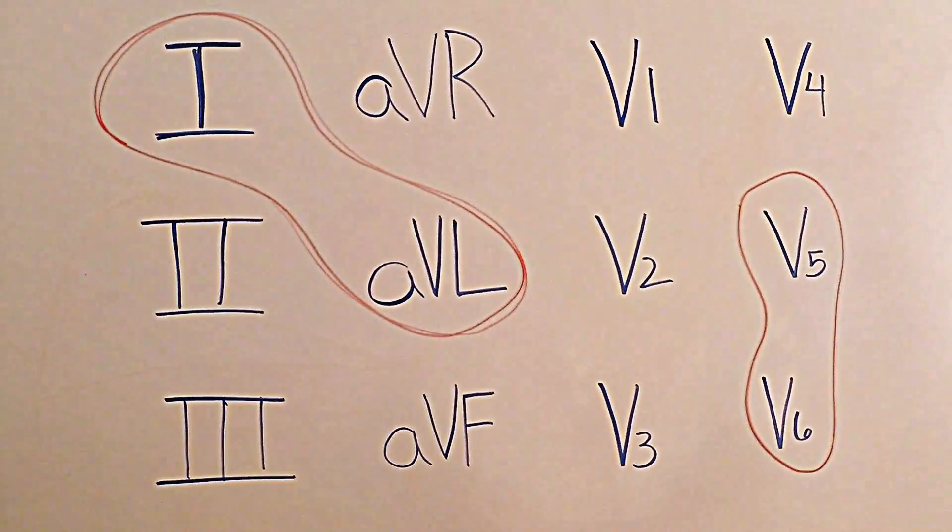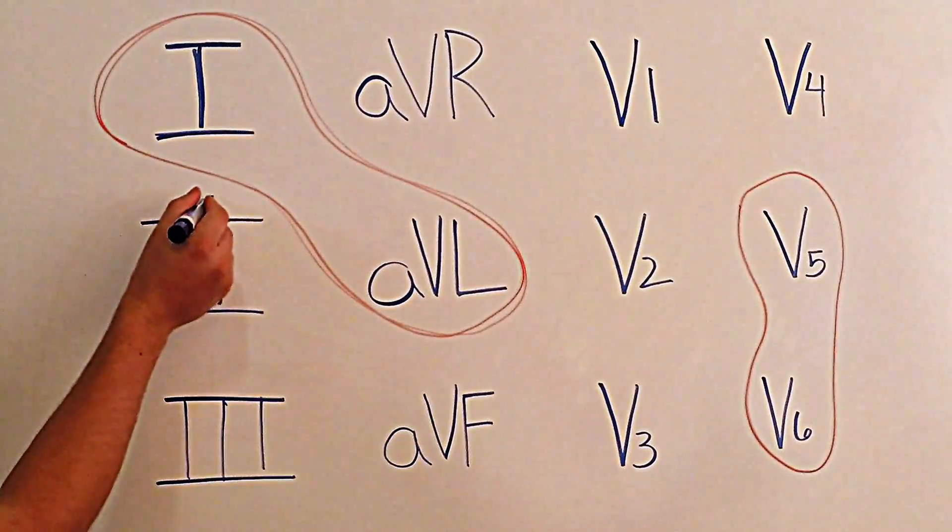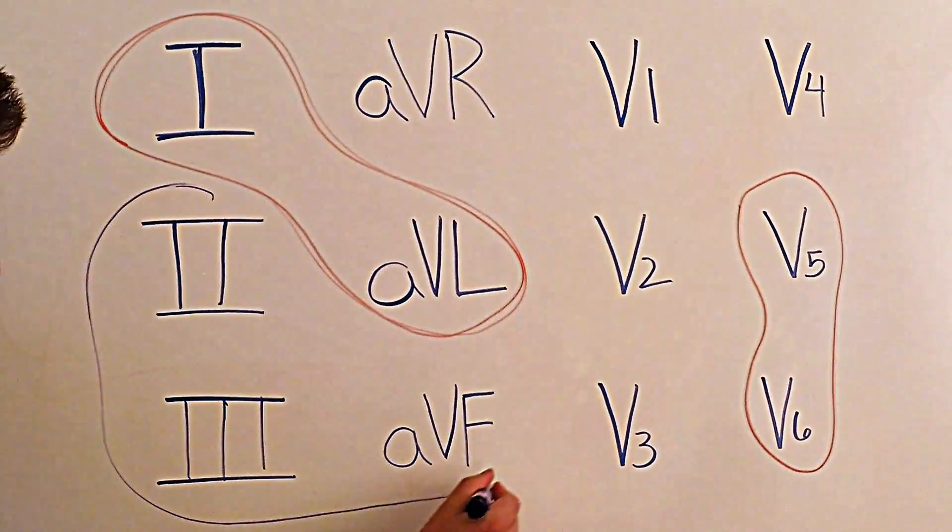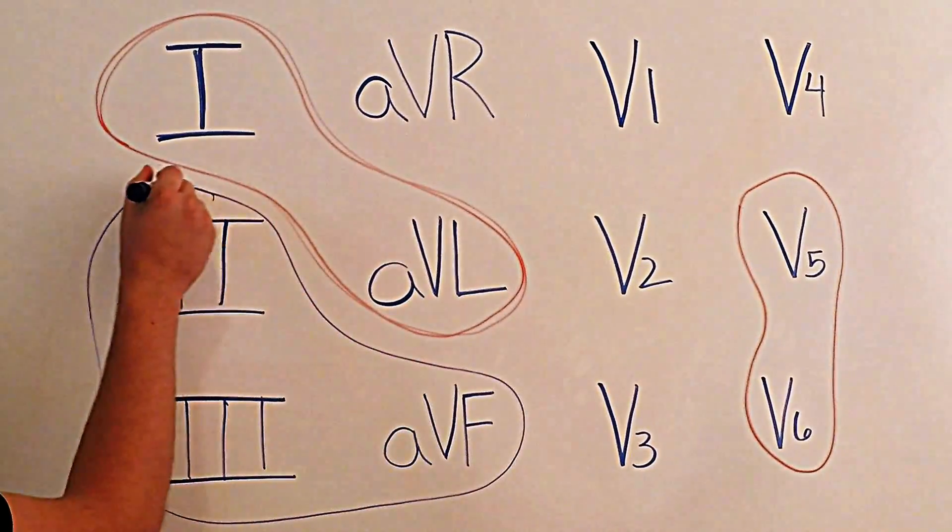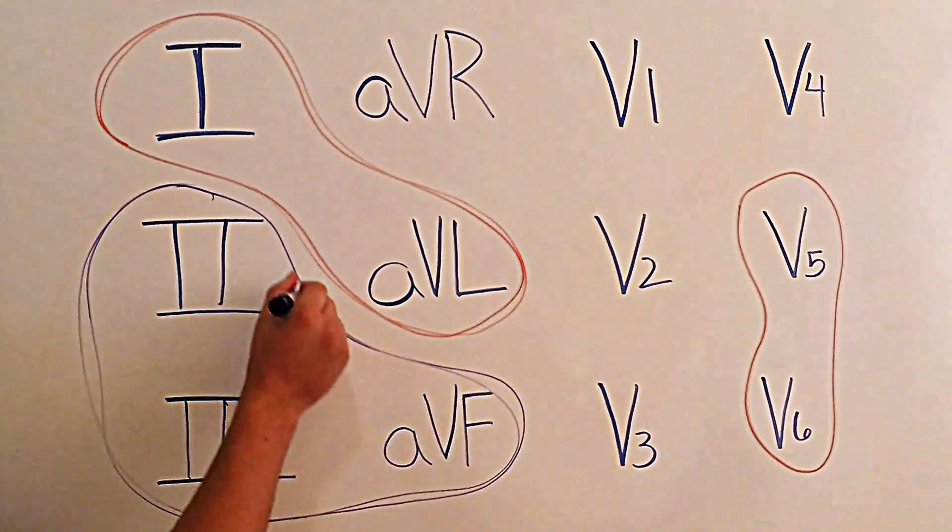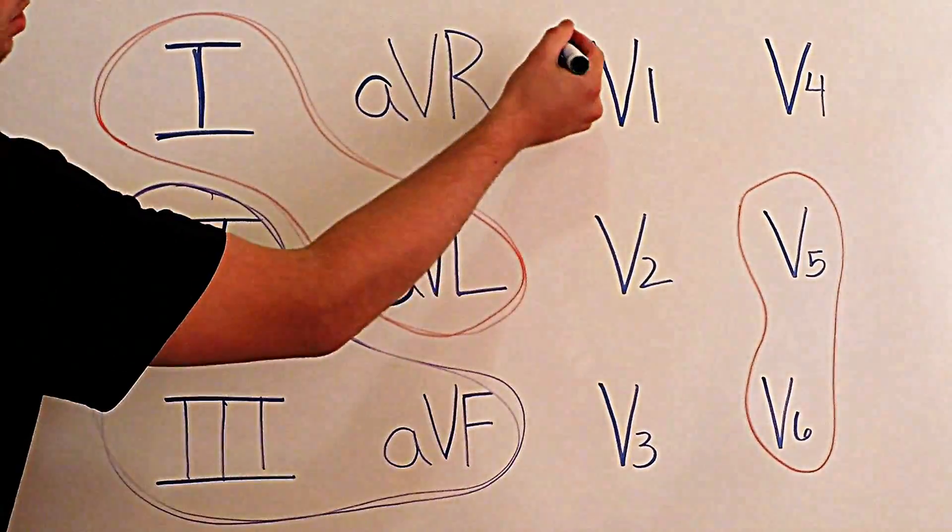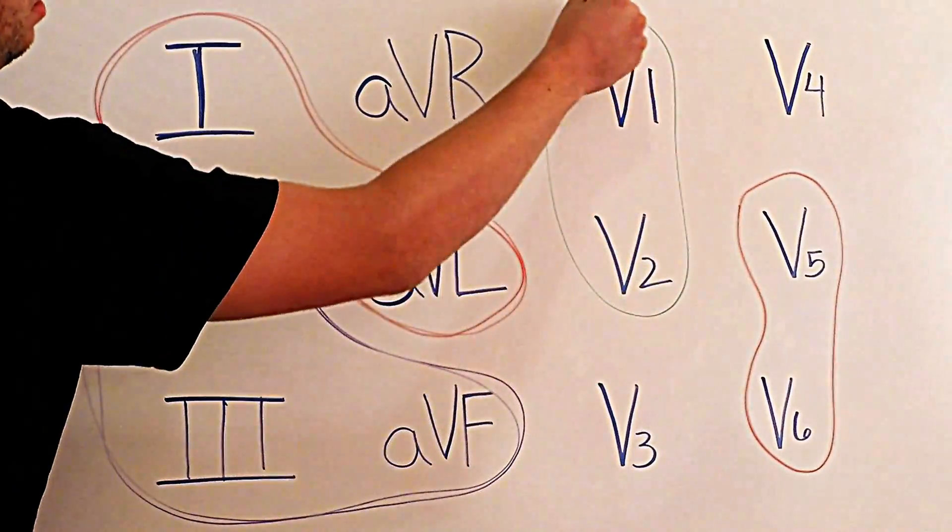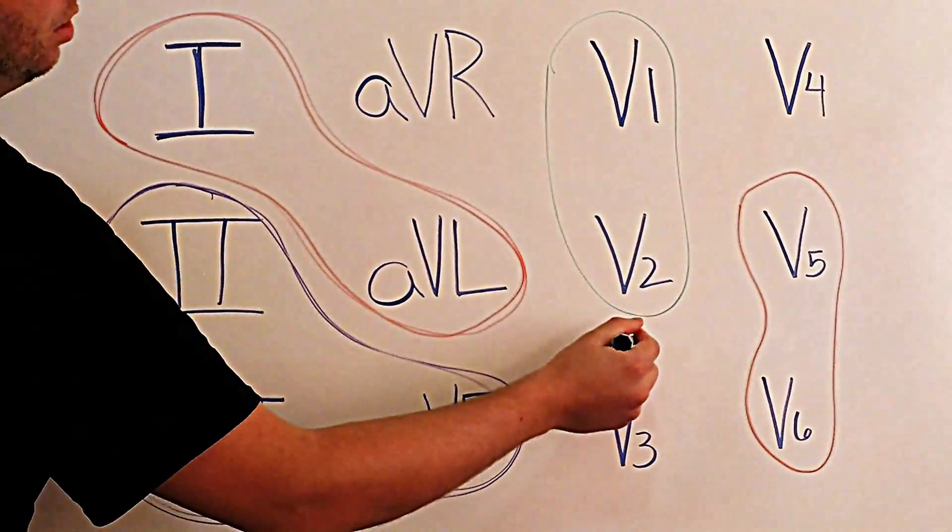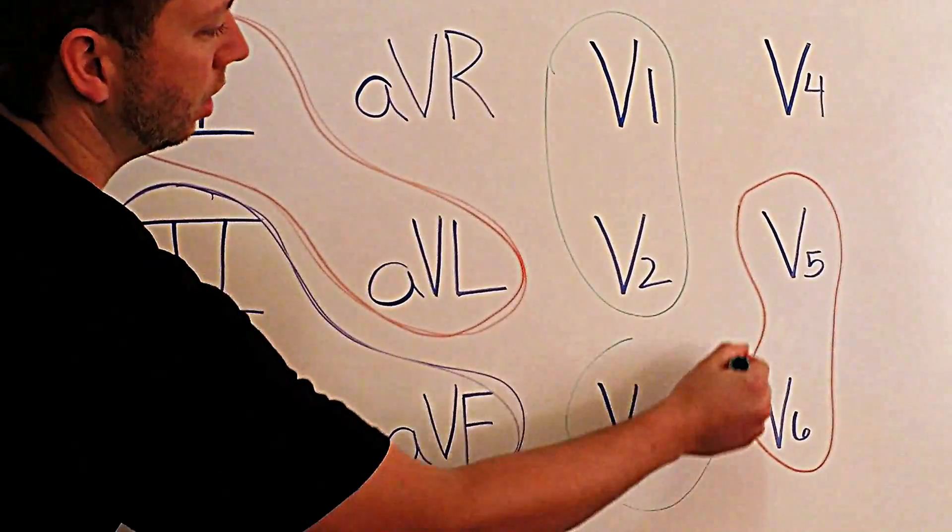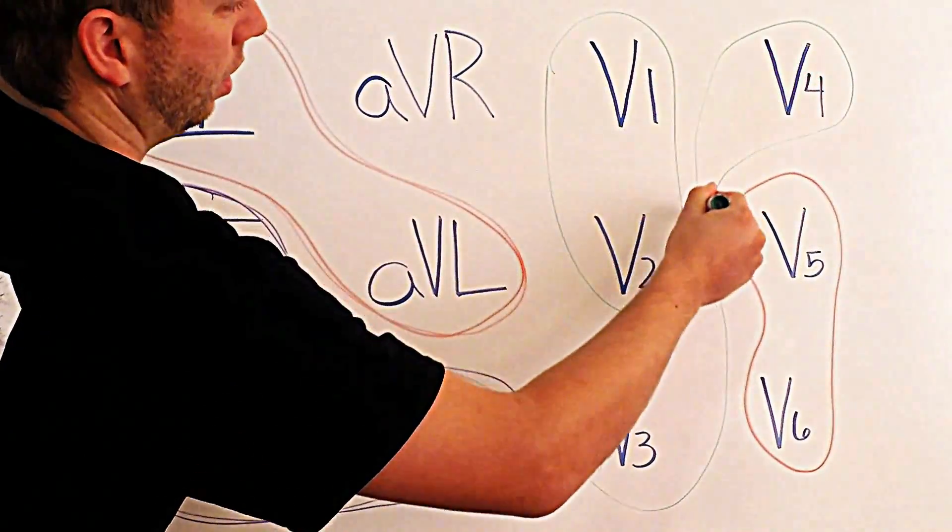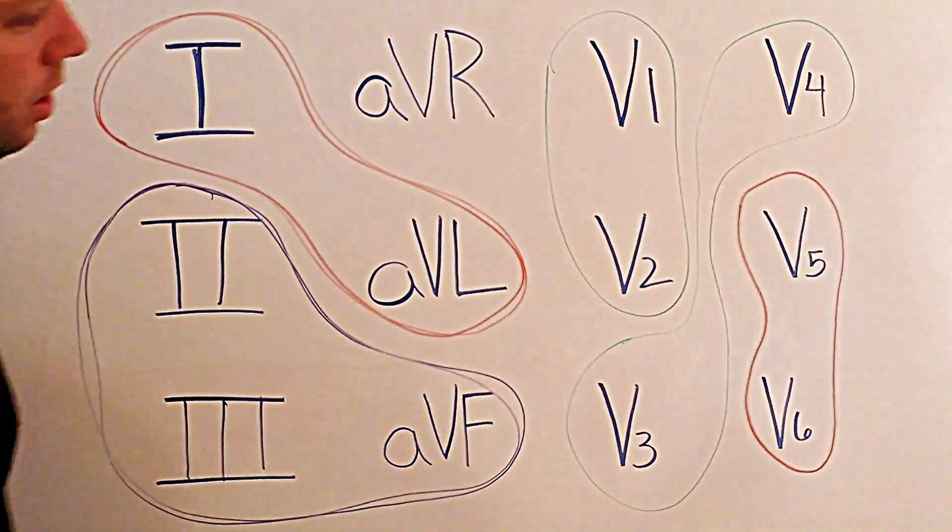You don't have to do it in a different color, I just like to kind of color coordinate to show you guys what I'm doing a little better. Now you're going to circle leads II, III, and aVF.